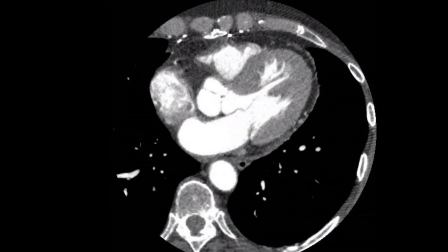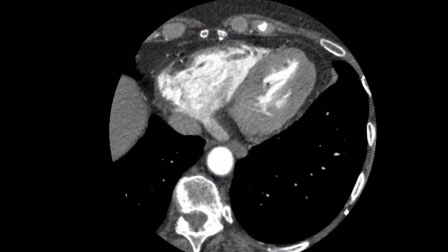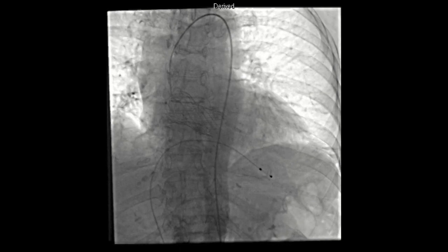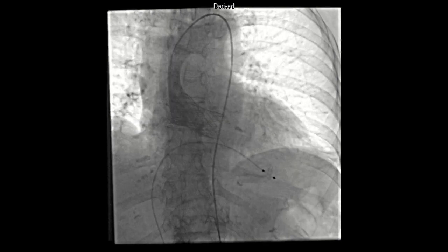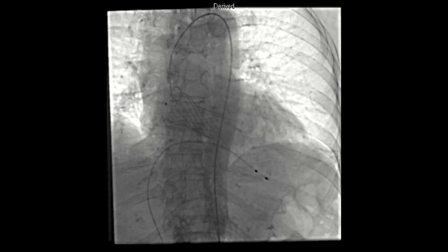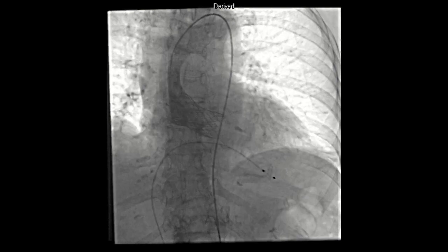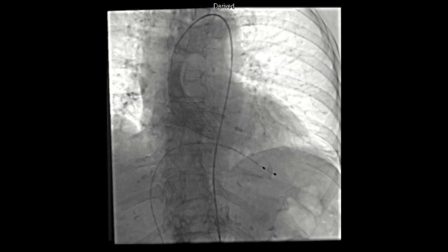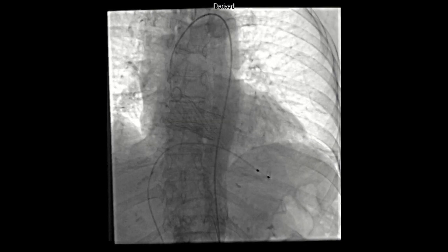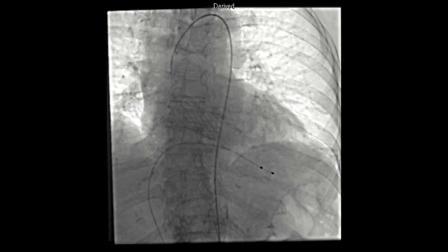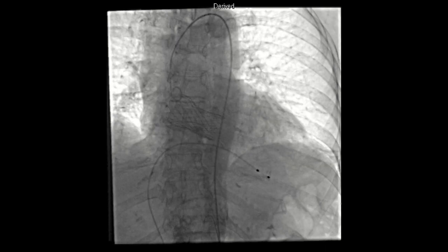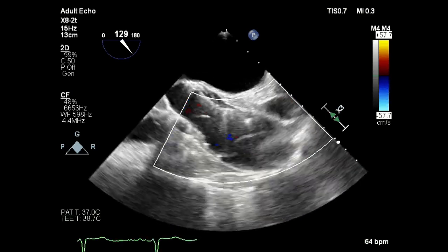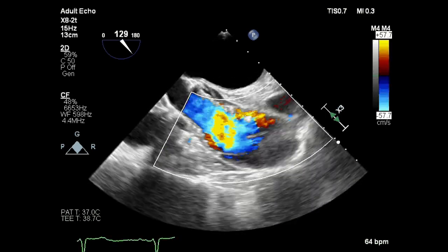The self-expanding valve was deployed, and what follows is our completion angiogram. Here on the angiogram, you can see a type A dissection extending above the upper frame of the TAVR valve. It was difficult to tell from these images if it originated from the level of the frame or below it at the level of the root. We had been using transthoracic echocardiography, and so we performed an emergent transesophageal echocardiogram to confirm the diagnosis. The TEE images shown here are what helped us confirm the diagnosis of a type A aortic dissection.